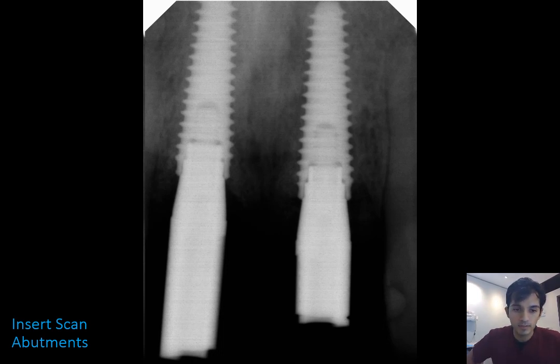We insert our scan abutments or scan bodies. And the obvious point here is that I use 2 different lengths of scan bodies. I'll show why in a subsequent slide. I also like to always take an X-ray and confirm the seating of these scan abutments. They're made of this radiopaque material that lets you see very clearly that you've seated this.